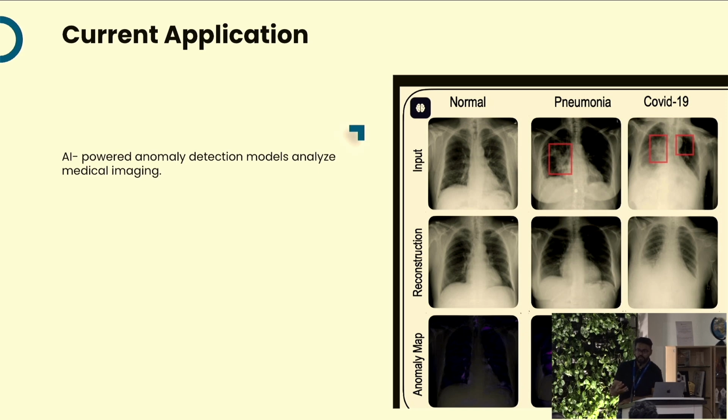So how the program is built is, every company sources data, in this case X-ray data, and we train the algorithm to understand how a lung nodule looks, how a tuberculosis lesion looks, how scoliosis looks. So certain health conditions, we train the algorithm, so the next time the algorithm sees a lung nodule, it flags it to the doctor, the user.